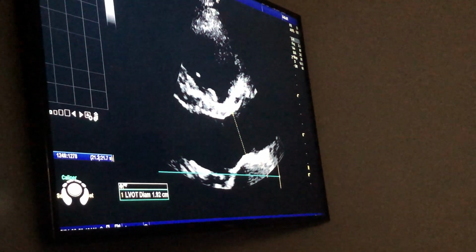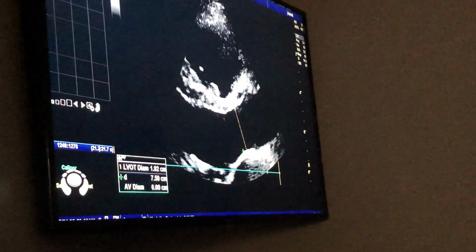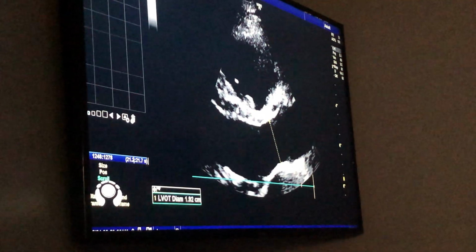They do this during OB ultrasounds, right? Well, not this, but yeah. Well, yeah, not this, but I'm just. Yes.